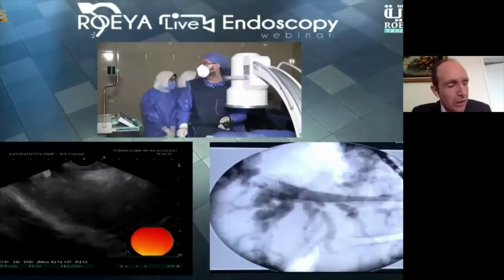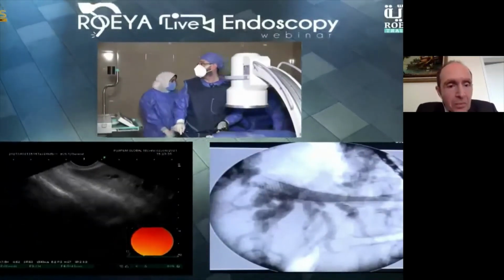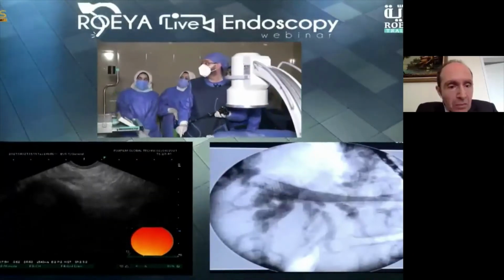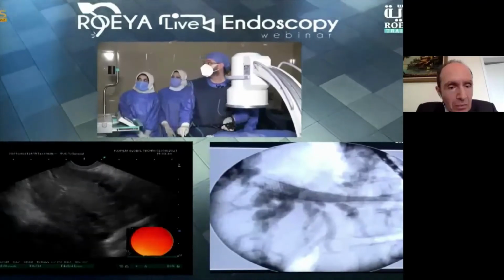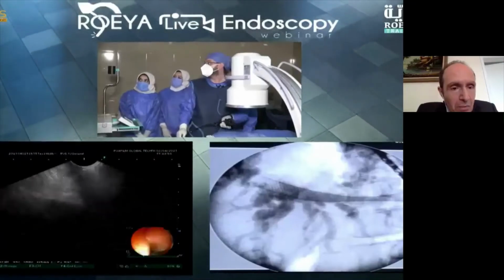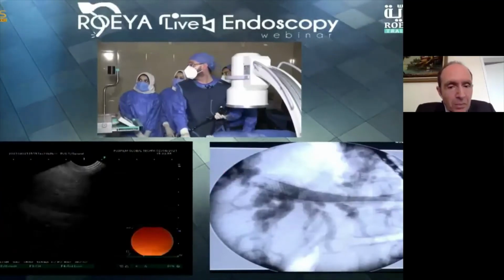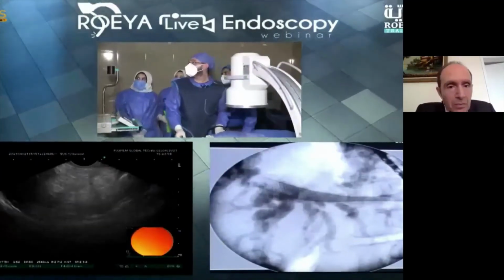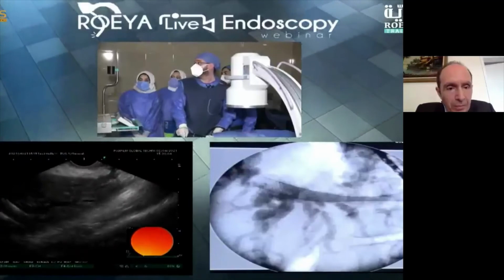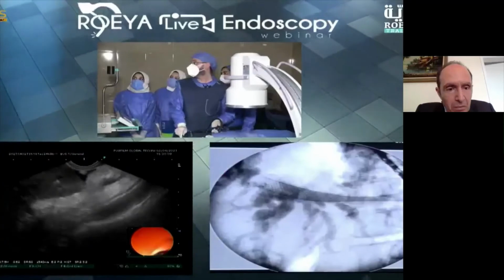We can see here the liver. Do you see the EUS image now? Yes. Okay, we can see nicely the left lobe of the liver with dilated intrahepatic biliary radicles. Now we will check for this large gallbladder mass. We will see it in a moment. Sometimes we can see the porta hepatis from the stomach, and sometimes we need to go inside the first part of the duodenum with anti-clockwise rotation to visualize the liver and the mass itself. Now we nicely see the left lobe of the liver. And moving back, we can see also a little bit of free fluid inside.